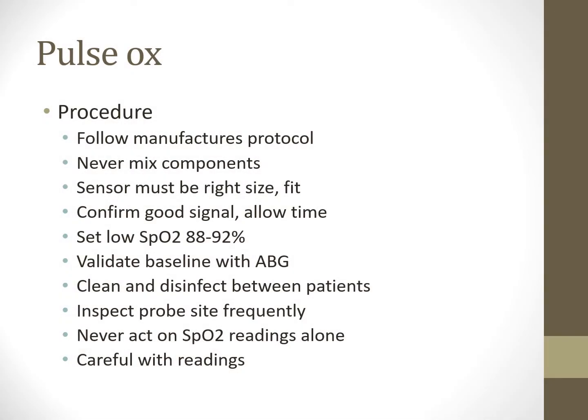procedure. Make sure you follow the manufacturer's protocol. I know Masimo had a different one than Covidien. So these are something that you just got to be aware of. And it's usually on the package of the pulse ox. I know, reading the package, novel idea.